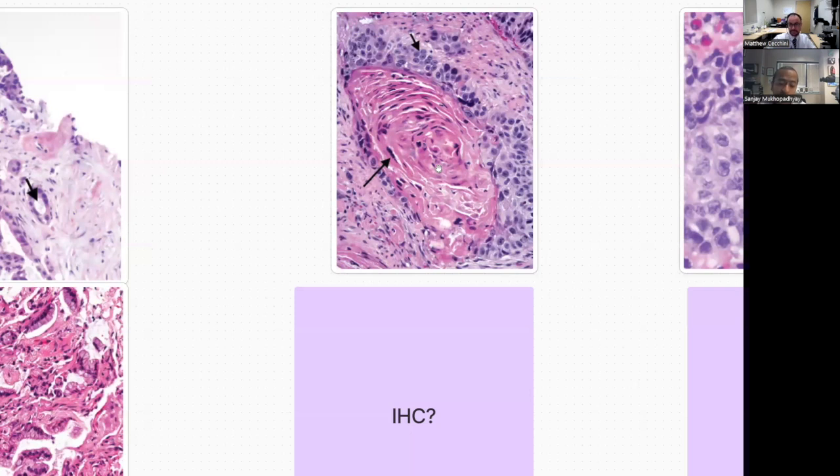It's very helpful to do it. I think HPV is the best thing to do here. High risk HPV CISH, and there you really can tell because lung is never positive for high risk HPV, at least in my experience. Never, and in the publications that I've seen, so there is a good rationale to do it. Otherwise, there is no rationale here, for me at least. Yeah, I agree with you.